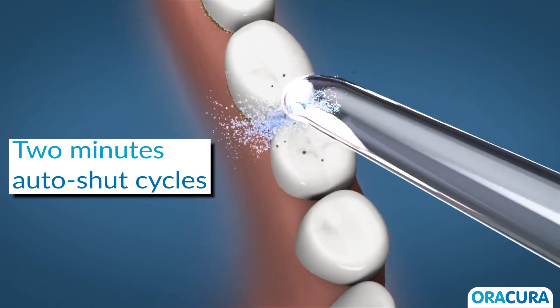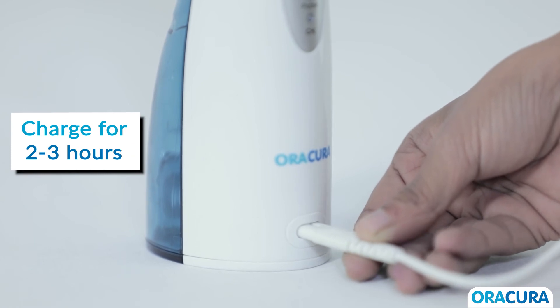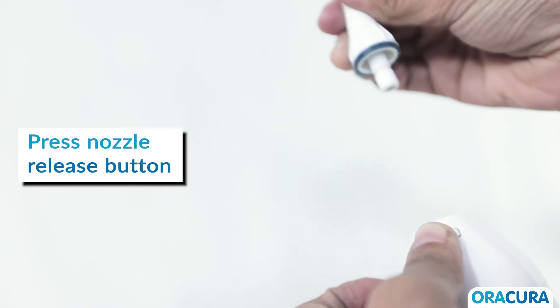The Arakira Water Flosser has a 2-minute auto shut cycle. Connect the USB cable that comes with the product via any USB port for charging, and charge the device for 2 to 3 hours. To change or remove the nozzle, press the nozzle release button and pull the nozzle out lightly by hand.